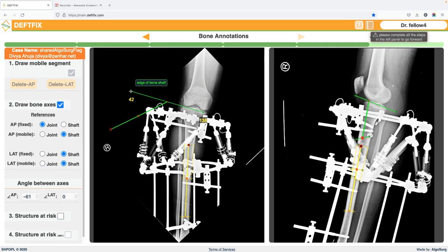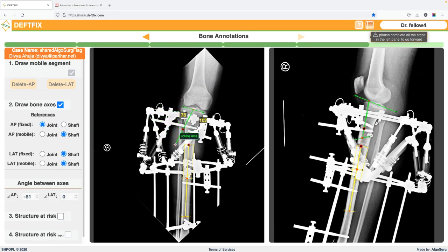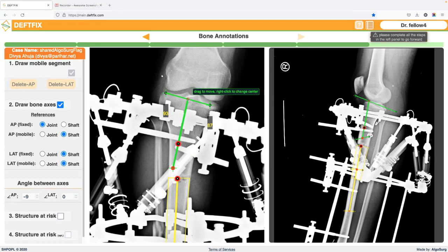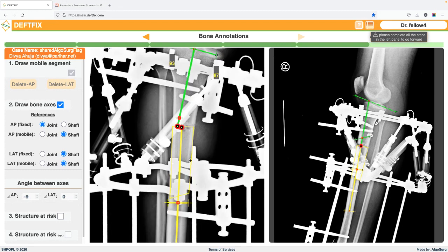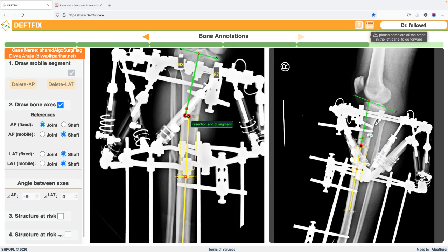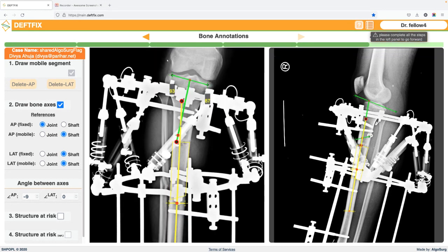We place the crosshair markers on the joint. As per our initial plan, the targeted MPTA is 87 degrees — this is the medial angle we need to change. Moving the marker, we place the projected proximal axis well centered, mark the resection end and the shaft for the distal mobile fragment. We can extend this line to identify where the CORA is coming. As per our plan the CORA was slightly more proximal, so we modify this slightly.